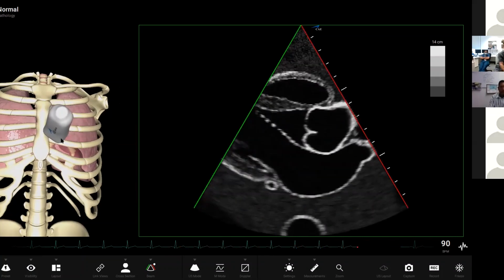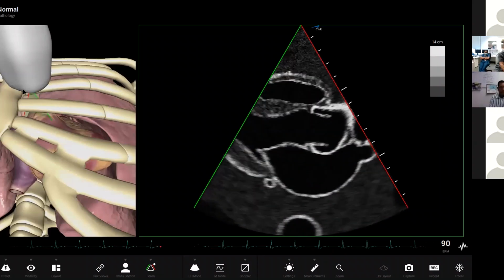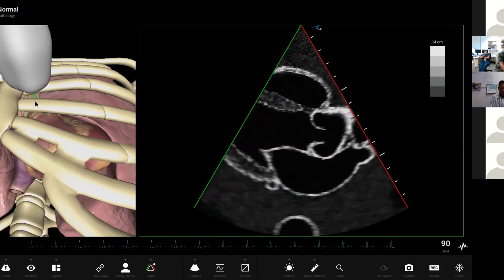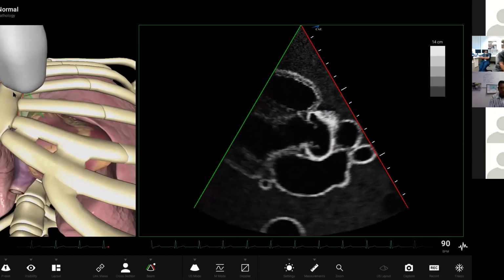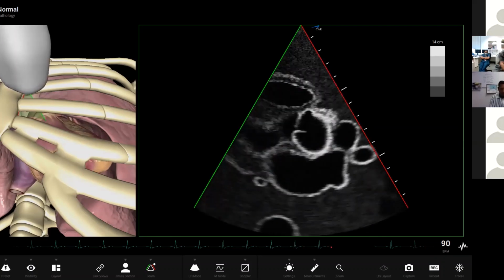And I'm getting that because I'm in that little 10 pence or 20 cent piece view, just that little area between the lung, in between the third and fourth ribs in this case. And if I wanted to have a look at the ascending aorta, I'm going to try and tuck myself in as close to that sternum as I possibly can, because that's where the ascending aorta is, right behind there almost.